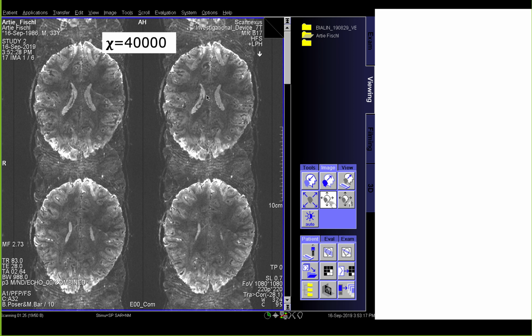However, you can also see that the ghost level is quite bad already. This ghost level is usually not so bad for functional imaging because they're very stable across time. And in functional imaging, we don't really care so much about how pretty the images are. We usually care about the temporal stability. So I'm willing to sacrifice and deal with these ghosts as long as I have improved my TSNR.